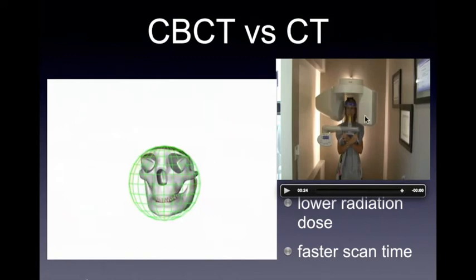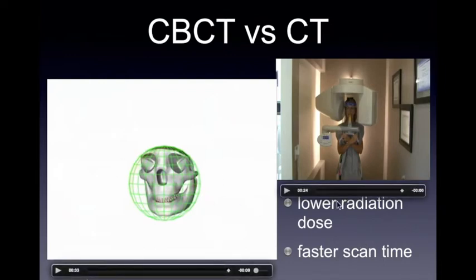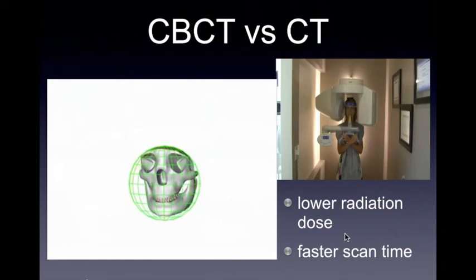You move around with the sensor itself, and the computer just simply adds on all of the images that it gets. Most of these CTs get more than 200 images. Because of technological advances in computing, it is able to recognize which slice was taken at what point. And then it just simply stitches everything together to create this three-dimensional image or three-dimensional view of your patient.